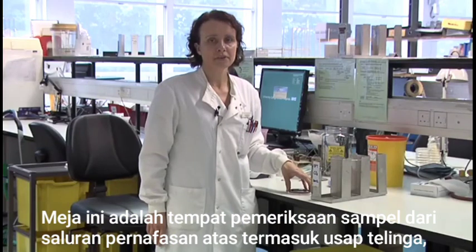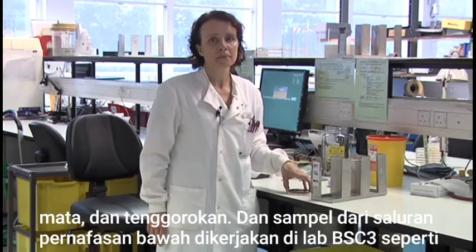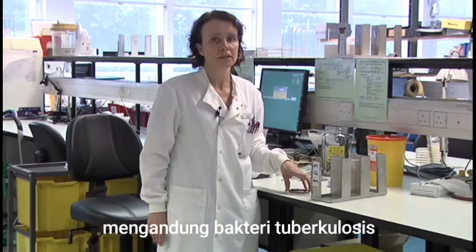This bench is our respiratory bench. Here we process samples from the upper respiratory tract, including ear swabs, eye swabs and throat swabs, and samples from the lower respiratory tract are processed in containment level 3, and samples include the sputum samples and bronchoalveolar lavage samples. They are processed at containment level 3 because there is a risk of the sample containing tuberculosis.